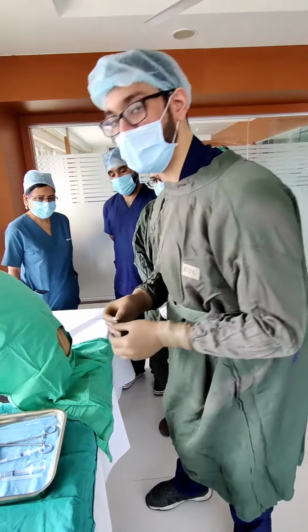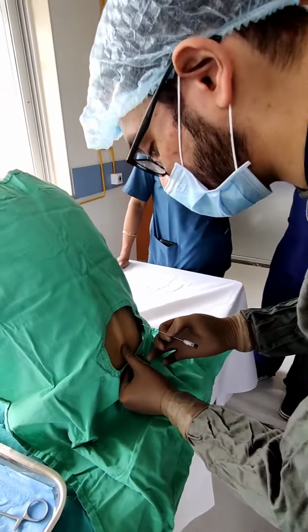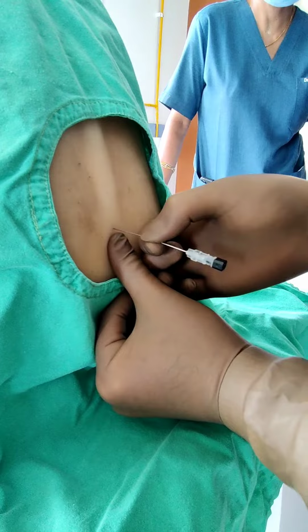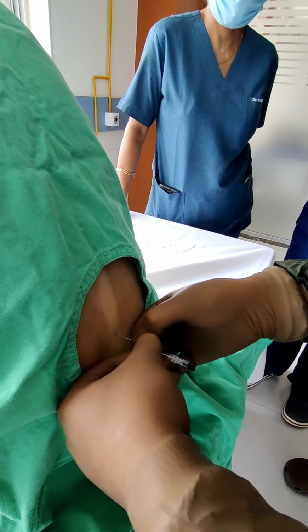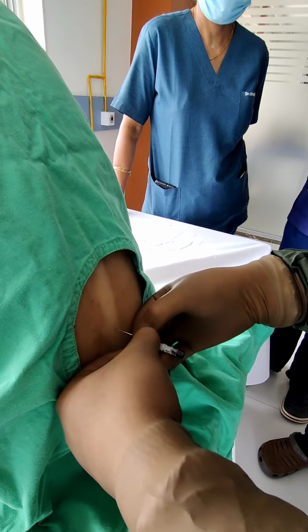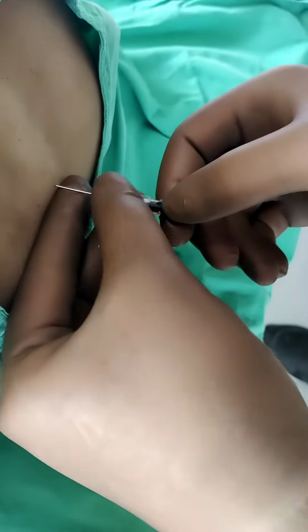So now I'll demonstrate how to perform a subarachnoid block. This is the space identified, that is the L3-L4. After proper palpation, we'll take a bold prick so that our needle is stabilized. As soon as our needle is stabilized, we'll stabilize our hands as well as the needle and introduce. So we have to feel for loss of resistance. That 2 loss of resistance will be there. Once the second loss of resistance has been felt, we'll remove the stylet and look for free flow of CSF.